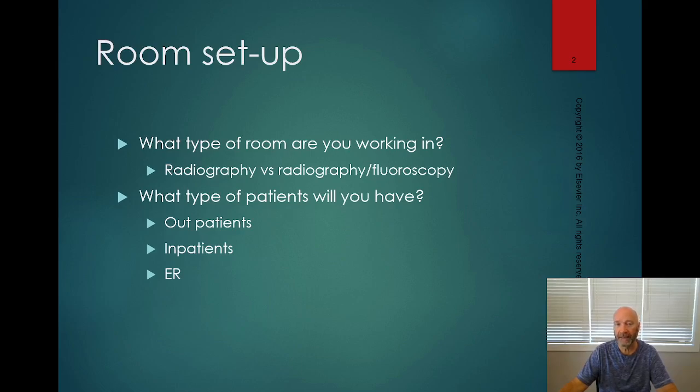You're probably not going to need things like barium in your radiography rooms. You're just not going to do a whole lot of barium exams, but if you do a high volume of trauma in some of those rooms, you may need some things like cystography. I've worked in trauma rooms where we did a fair number of cystograms for ruptured bladders. So consider your room type. If you're in a radiography room that neither one of those two things applies, then you're probably not going to need either one of those.